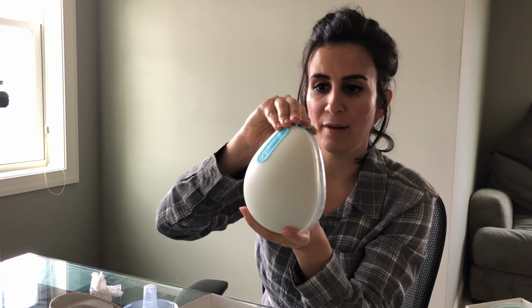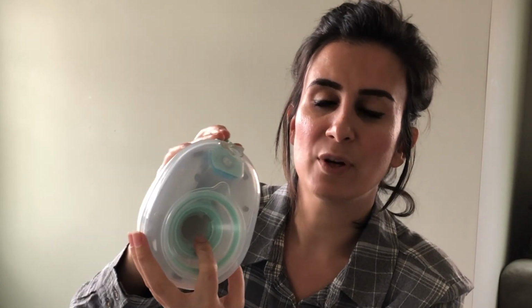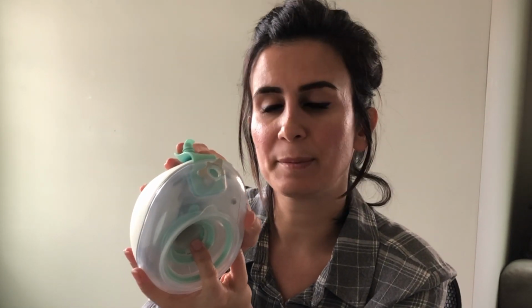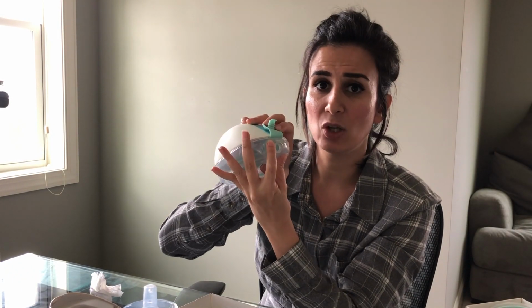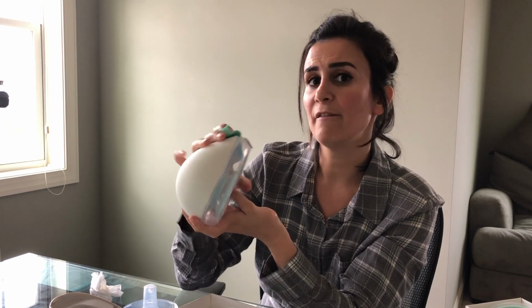When you want to pump, you want the little one on. So you turn the one. The reason for that is, again, I will show you up close, but there's a little vent hole. And for it to properly suction, you want that vent hole open. So when you place it, the dial on 1, you're leaving that vent hole open.